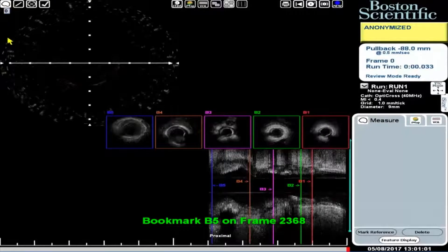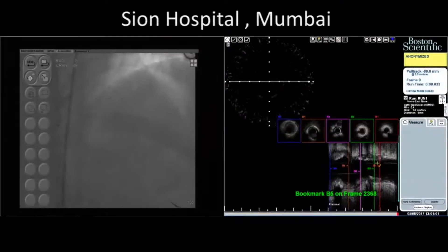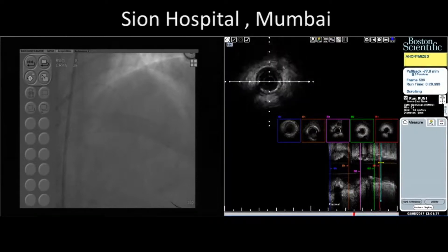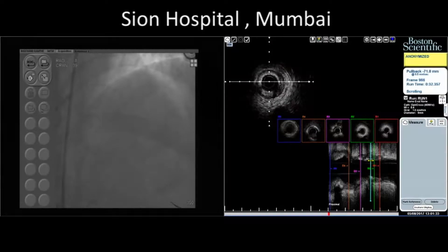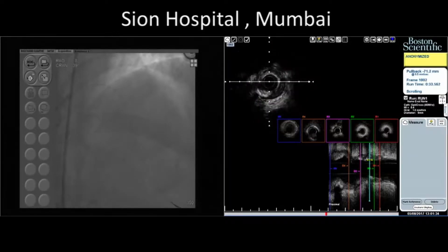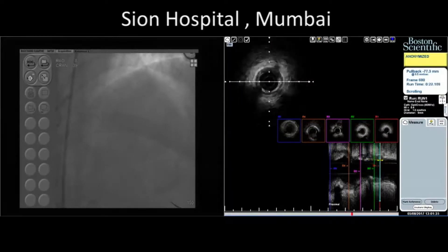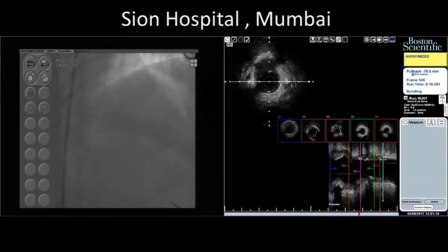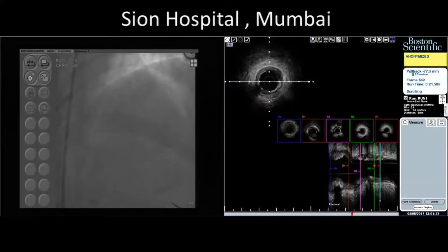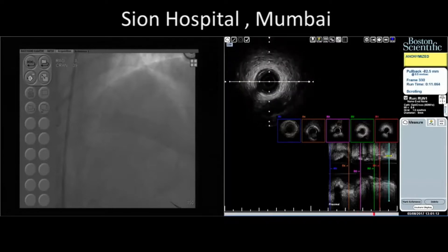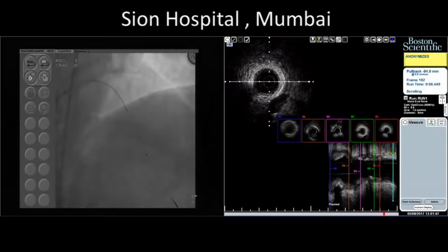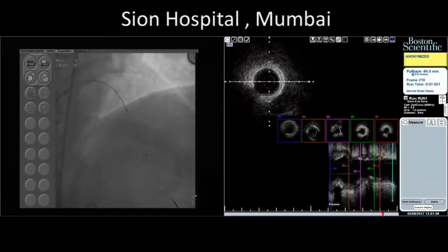Let's get a 2.75. So it will require differential dilatation. Let's flush it — 2.75 for 3.0. Knowing that the distal is about 2.0, let's go to the distal vessel. Looks like that was about 2.75. So we take a 2.75 and then we dilate proximally to 3.25 and so.